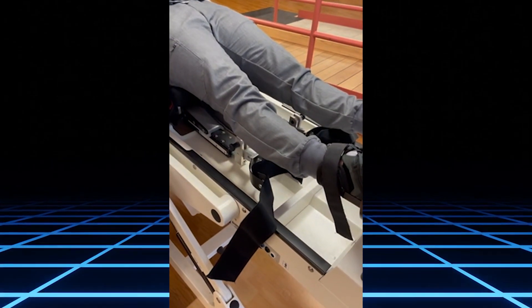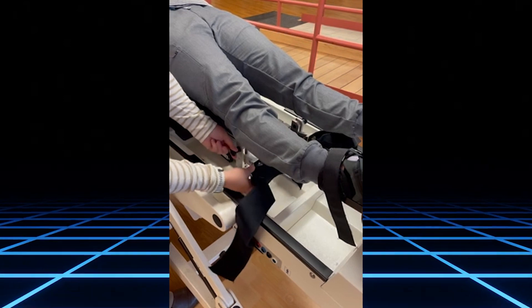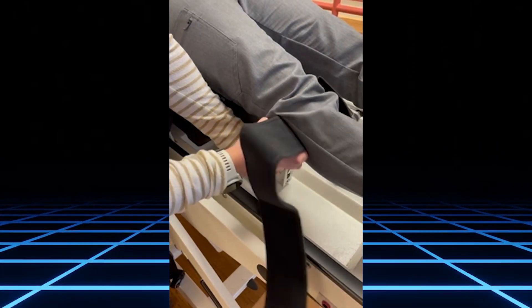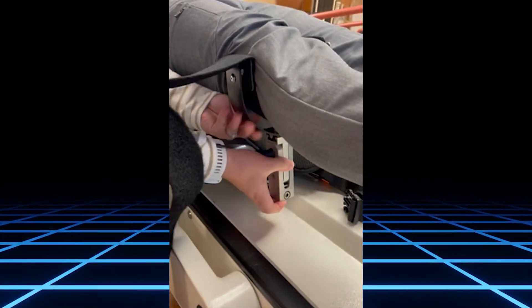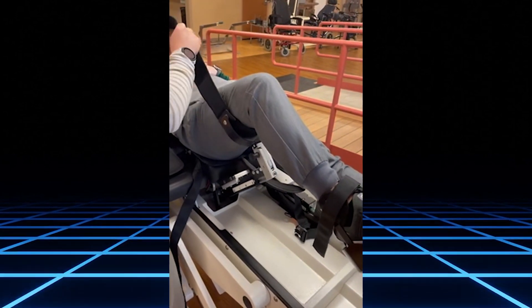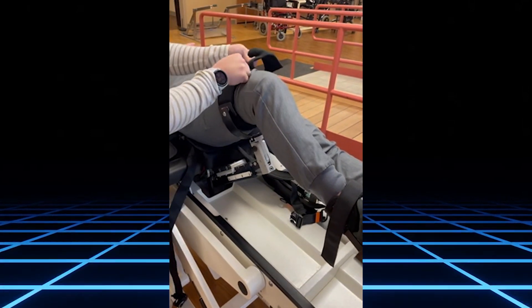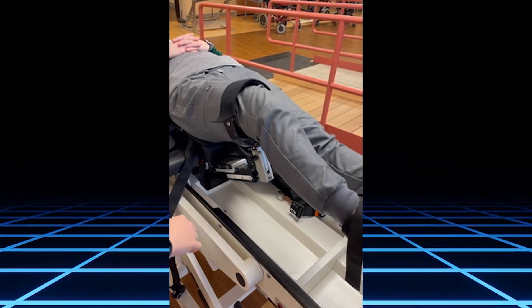In order to get the cuff up around her thigh, pull the black tab out and bring it up. I've found the easiest way to get it in the appropriate spot is to raise the whole leg up and it will sit right into the correct spot. Then it's just velcro — you want it nice and snug because as she comes up into a standing position it does tend to get looser.